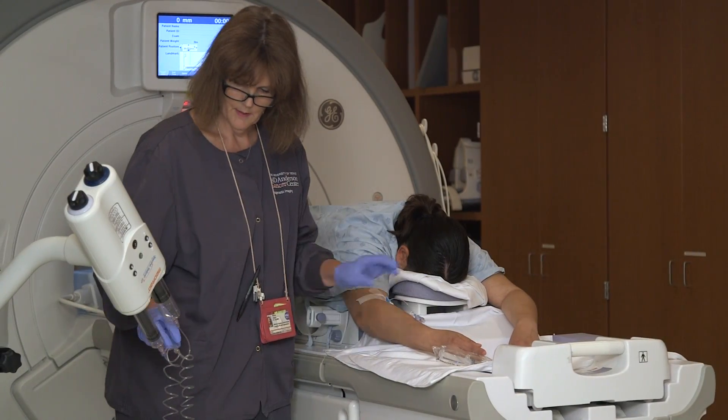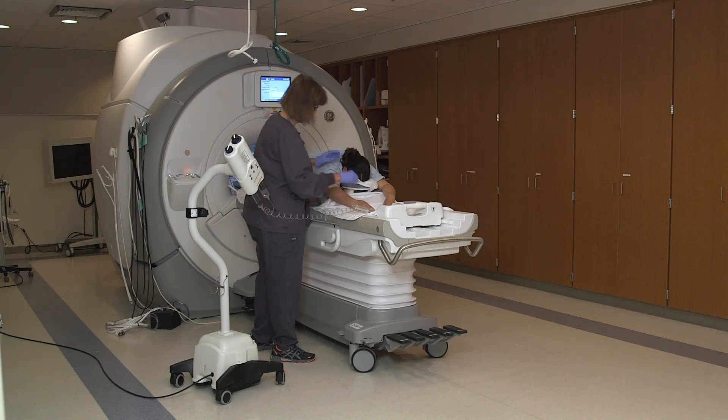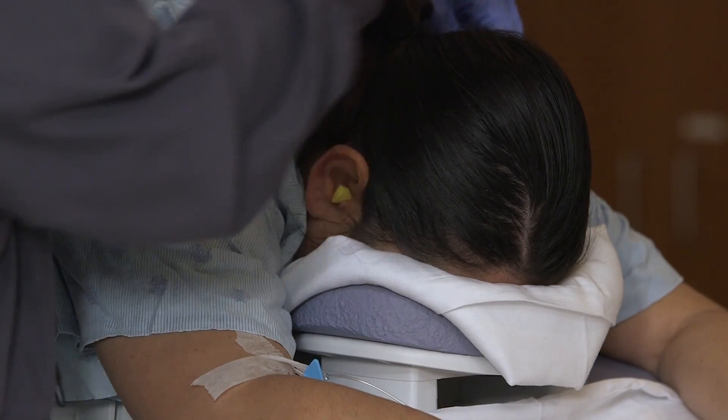Contrast is injected into the IV while images are being acquired. The contrast will highlight abnormal areas on the image. It is noisy during the exam. Ear plugs are provided to reduce some noise, but you can still hear and talk to the tech through the intercom system.